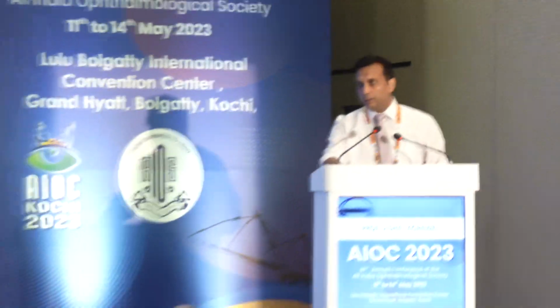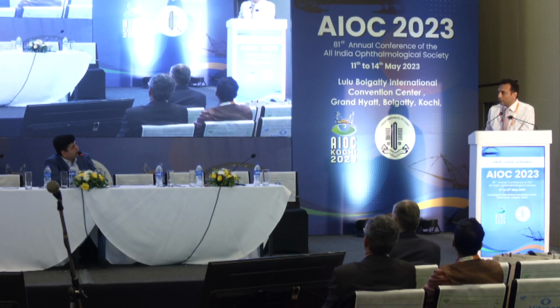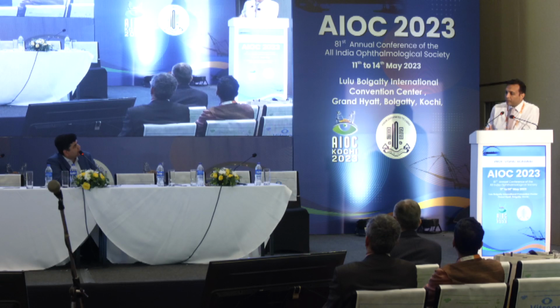They are very challenging cases. Which cases do you feel like operating on early, or what criteria do you decide on? There's no point in touching these patients if they have ambulatory vision and a good navigational vision. If the only indication of surgery is a progression and a deterioration with serial OCT follow-ups, you might see significant fluid and significant traction in the OCT, but the patient still might be comfortable. The patient tells you, like Dr. Lal said, that the vision has gone down and he or she is not able to do the daily activities now. Then you touch these eyes.